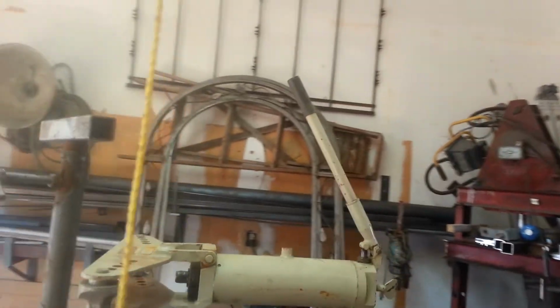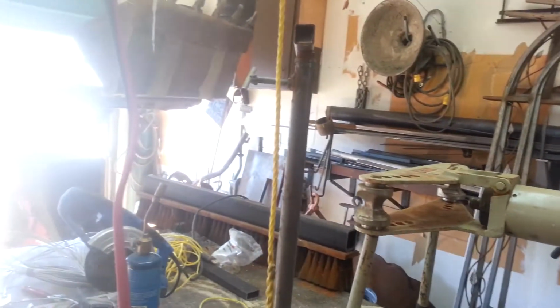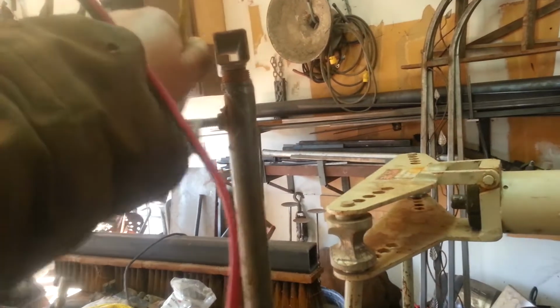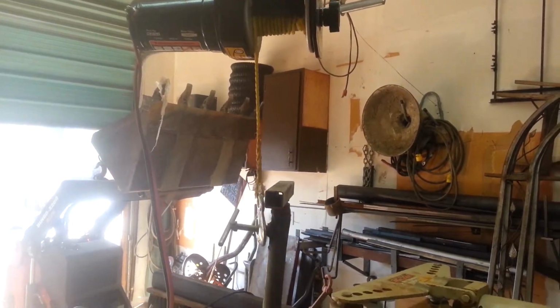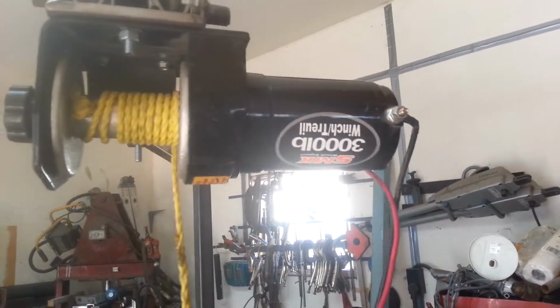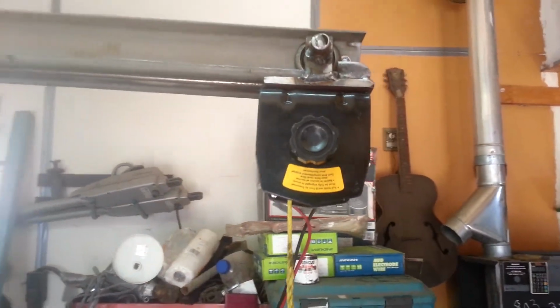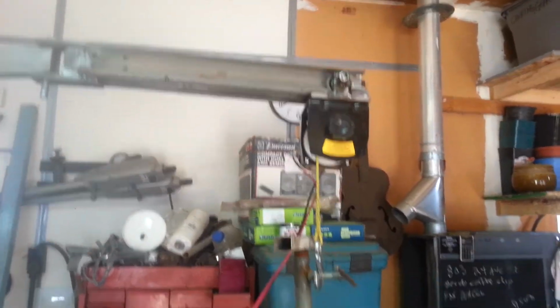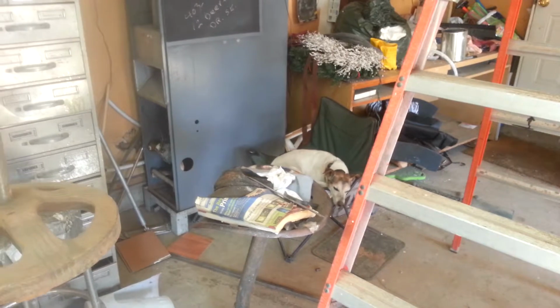So now I've got here a stand in my shop that's approximately the same weight as the wheelchair, just to show you that it will lift. All the weight is on it, and it's put out right to its extension, and it has actually no trouble carrying that. I'm sure I could add another 20 or 30 pounds onto it, but it's just not made for that. The stand has a heavy cast iron base, and actually my Jack Russell weighs the same as a wheelchair. Well, I'd have to have a harness for that.